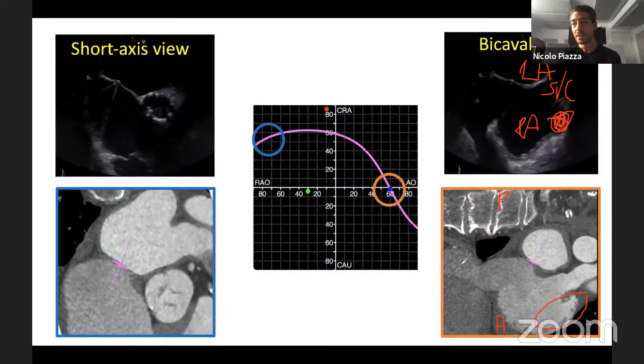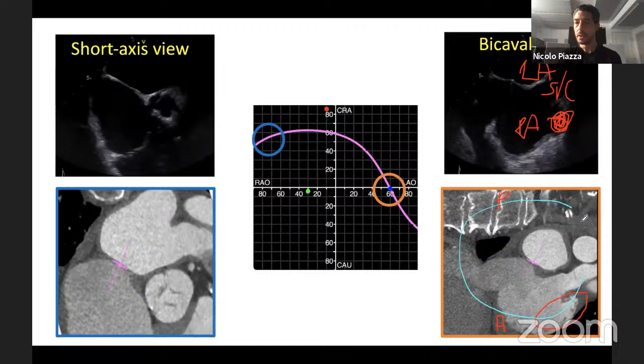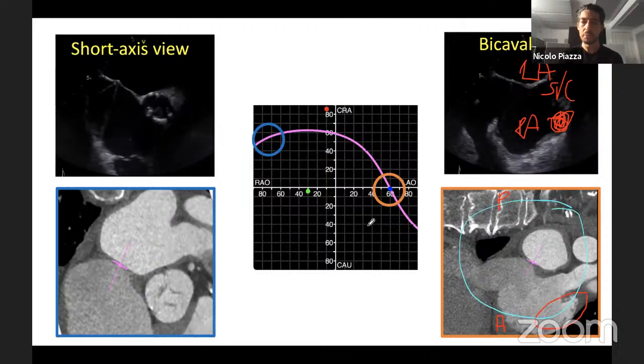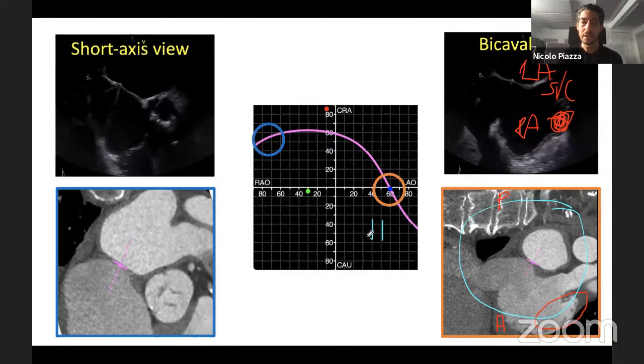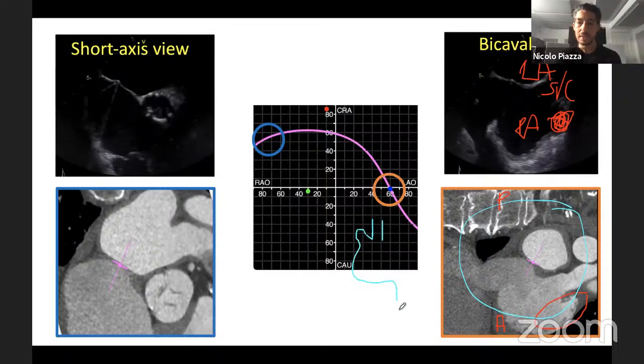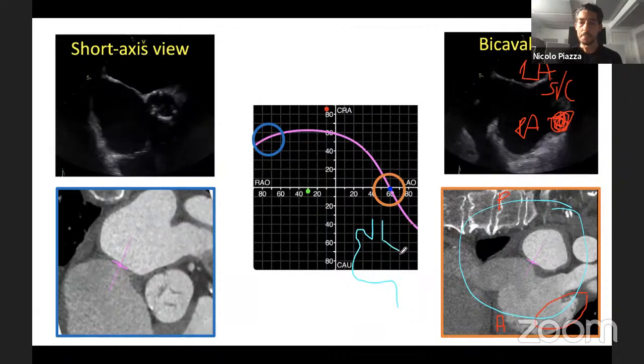What's happening, okay, is the following. So I'm going to take this picture here, and I'm going to orient it as we see it on fluoroscopy. So we would get the SVC, we would get the right atrial appendage, the right atrium, we'd get the IVC, we'll get the atrial septum.